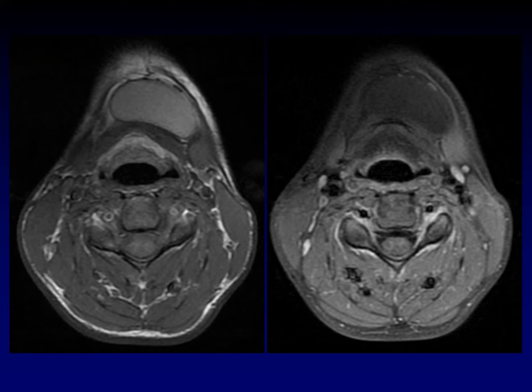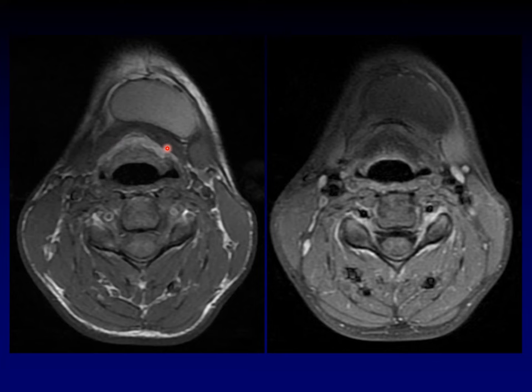The trick here is that most anterior midline neck masses are thyroglossal duct cysts. Why is this not a thyroglossal duct cyst? That diagnosis of TDC relies on a tight relationship between the mass and the strap muscles. Notice that here the mass is anterior to the strap muscles, not inside them. The strap muscles are not making a claw around it — it is superficial to the strap muscles.